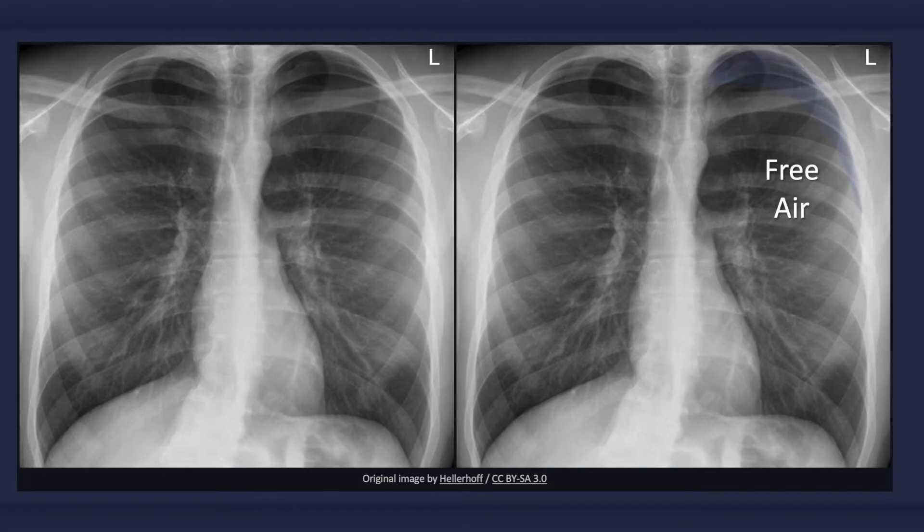In regards to detecting a pneumothorax, the most important aspect is simply looking for it. The x-ray may be almost entirely normal, except for a small crescent of lucency next to the lung, which can be easy to miss.